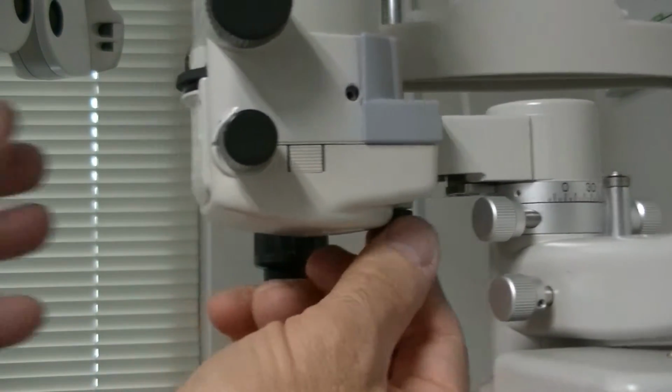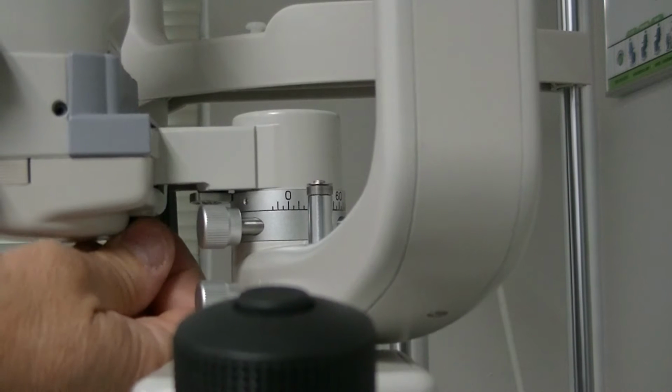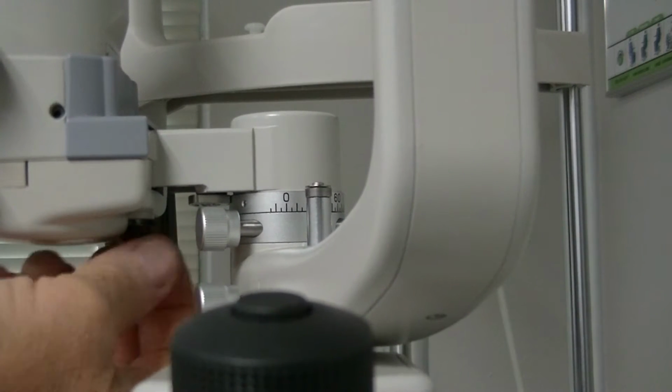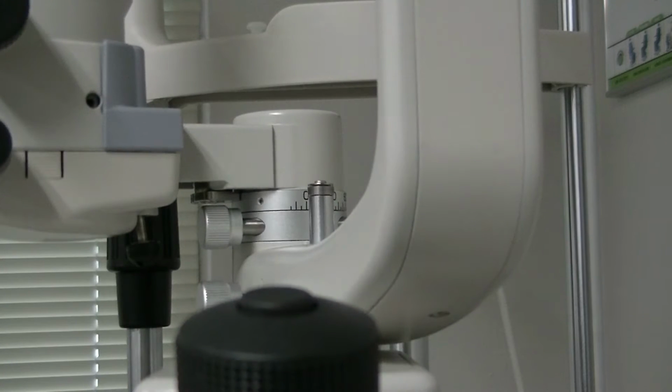Take your fingers and you have to unscrew that screw, like this. Now once you have it unscrewed all the way, it'll sort of flop around in there like that. That's what you want. Okay?